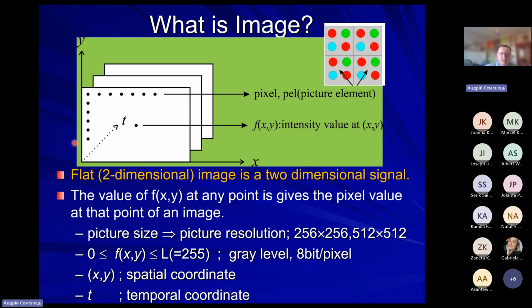Every time we have to keep in mind that any image is composed of pixels, and mathematically, at given XY coordinates, we have a function which gives us information about pixel characteristics at the Z coordinate, like intensity value or colors, etc.